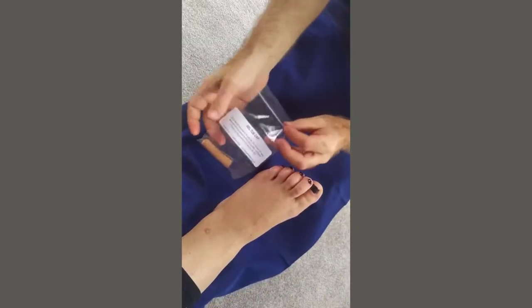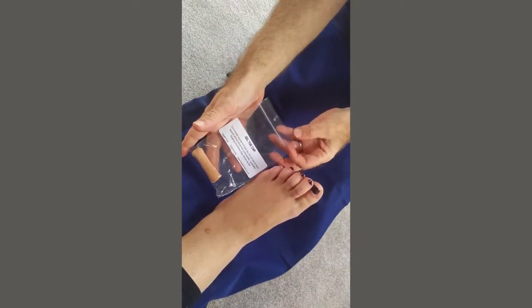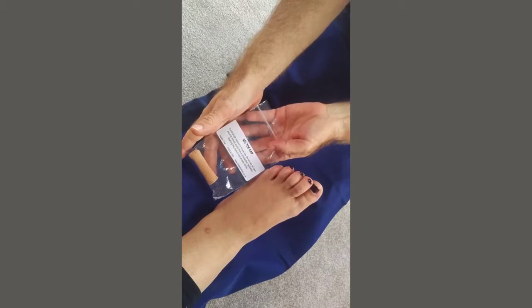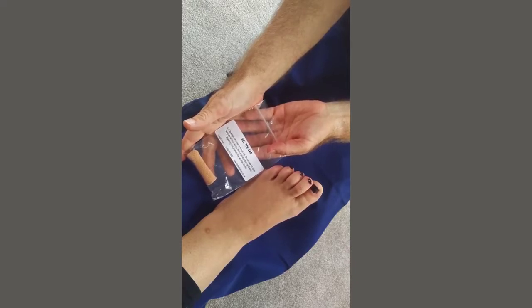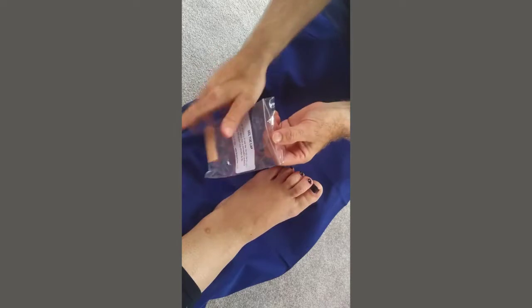Welcome to First Aid for Feet instructional video on the Gel Toe Cap. The Gel Toe Cap is supplied with instructions that say: cut to length required to fit over toe; do not use on open wounds without advice from a chiropodist or podiatrist; washing this product may shorten its life.